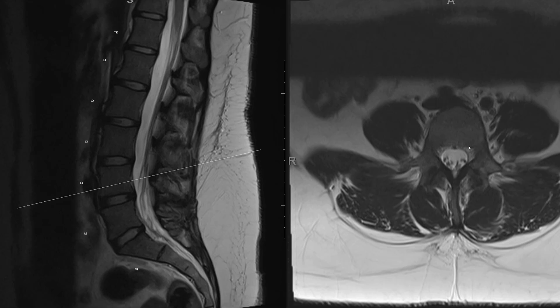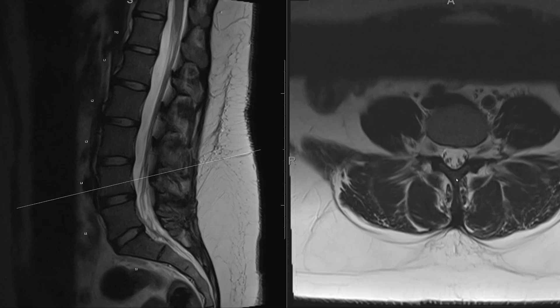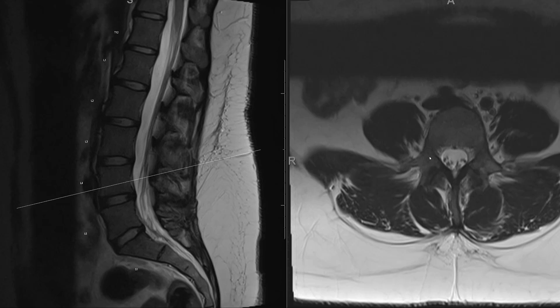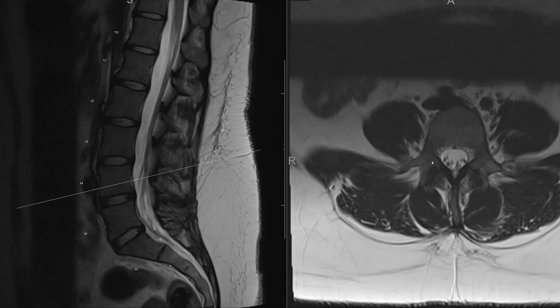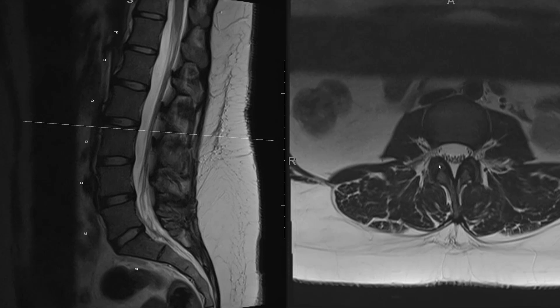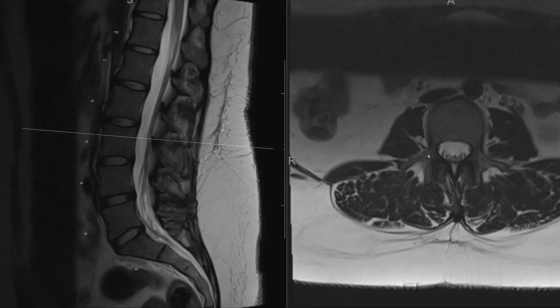Let's look at the vertebral body itself in the axial view. Here we have the body of L4. Extending back to form the posterior elements are the pedicles, then we get into the region of the pars interarticularis, and then the lamina extends back to join and form the spinous process. Laterally we have the transverse processes extending out on the right and left sides.